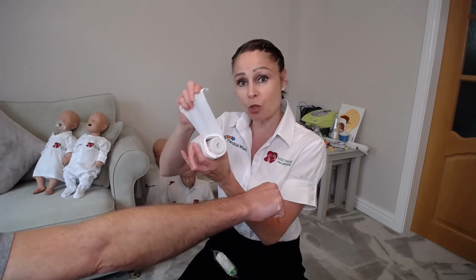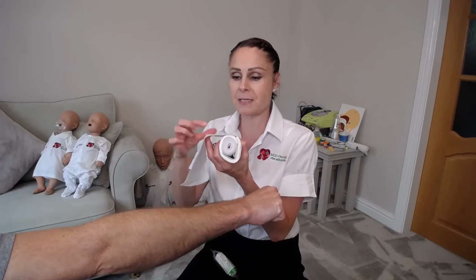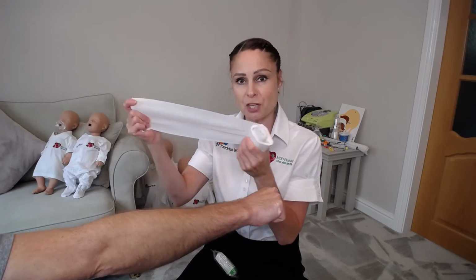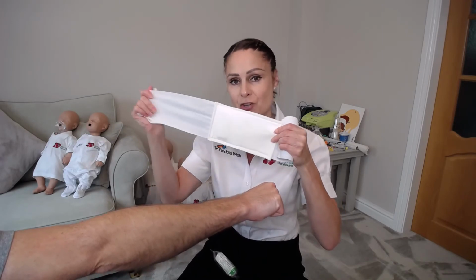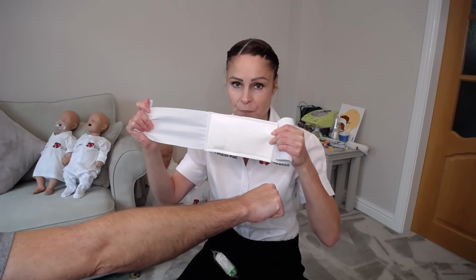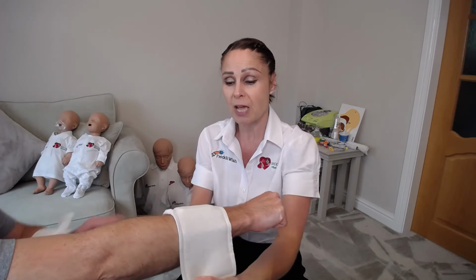Here we have an arm. So what we're going to do now is unwind the short end, but the bandage is very different. This is very wide, very sturdy and very elasticated, which leads you to the large, very thick pad in the middle, which has a pressure pillow. The pressure pillow allows you to have direct pressure as well as indirect pressure from the bandage. So first of all, you place the pressure pillow directly over the wound and get your patient to secure it in position because it will move.